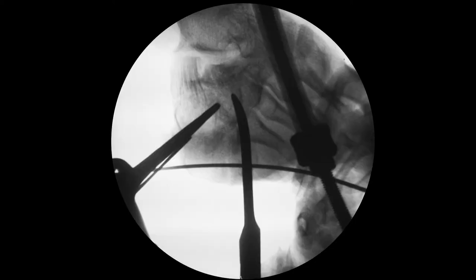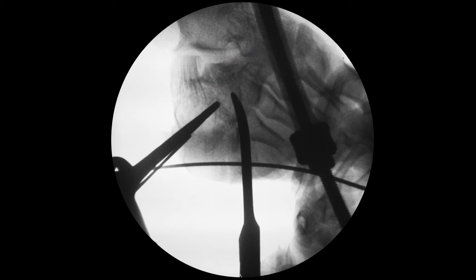Please note that the fragment considered to be the starting point for reduction — it is called the constant fragment — is displaced to the bottom and also requires reduction when using this technique. This technique changed the paradigm: the calcaneal tuber held by a distraction device becomes the starting point for reduction.